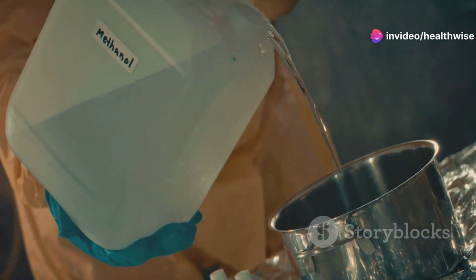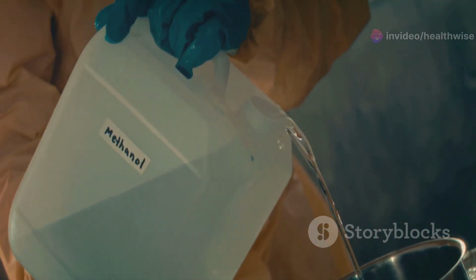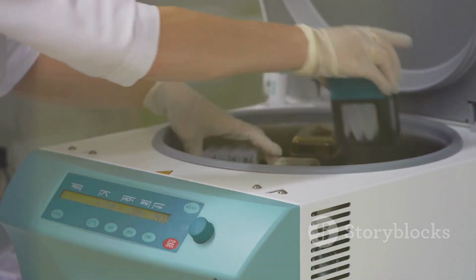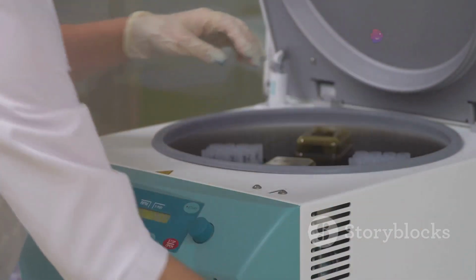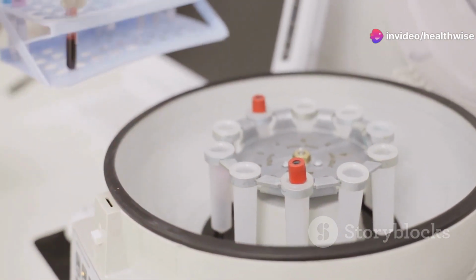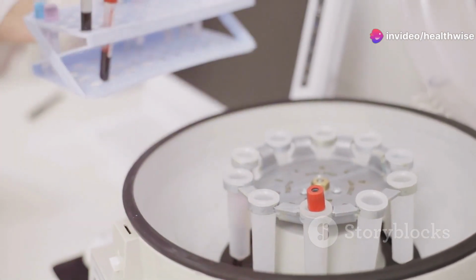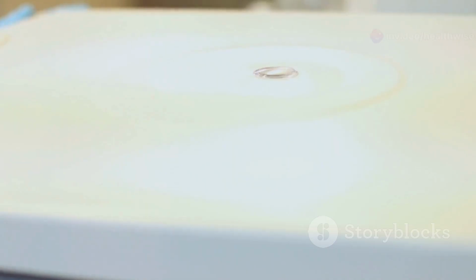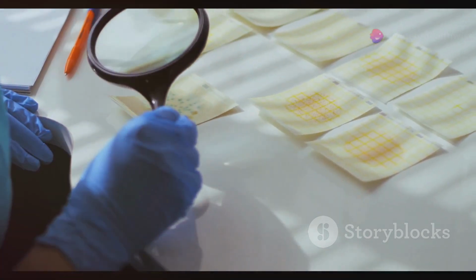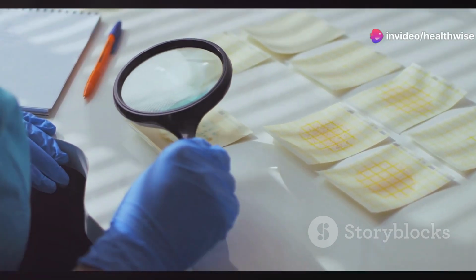6. Add 3 milliliters ether, stopper the tube and shake vigorously. 7. Remove the stopper and centrifuge at 1,500 revolutions per minute for 2 minutes. 8. You'll see 4 layers: sediment containing parasites, formalin, fecal debris, and an upper ether layer. 9. Remove the top 3 layers and resuspend the deposit. 10. Prepare saline and iodine wet films and examine them under the microscope.